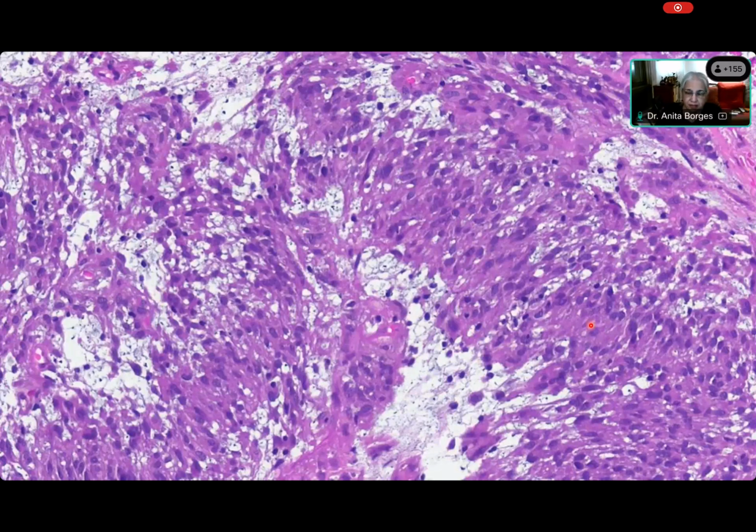Okay. Do you have a definition for degeneration? What is actually happening over here? What's happening to the cells? Cells are seen to be merging in the myxoid. So you think that there is a myxoid change over here? Or do you think that these cells are undergoing apoptosis? So what do we mean by degeneration?